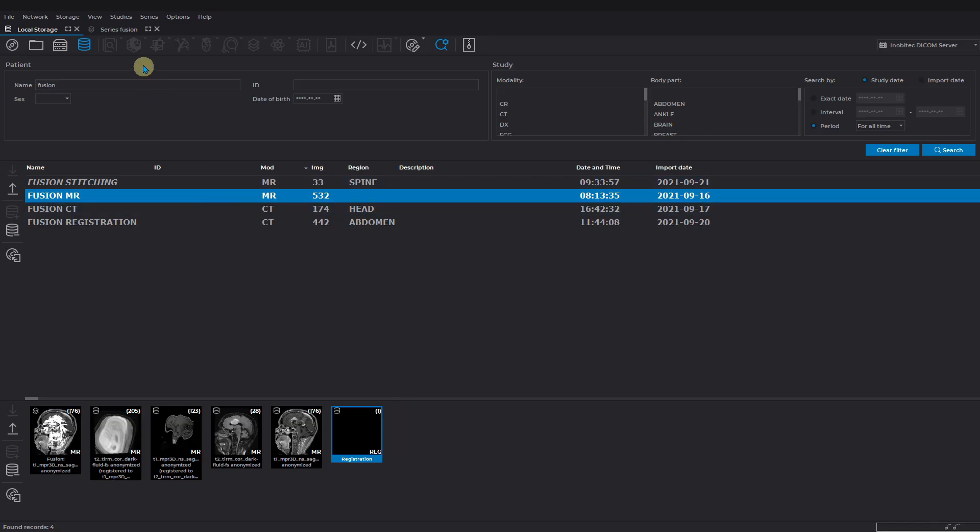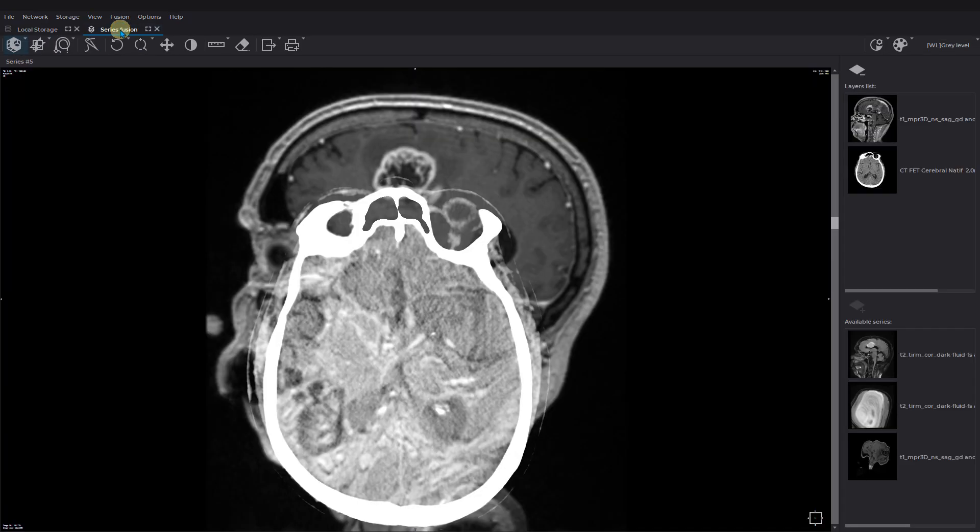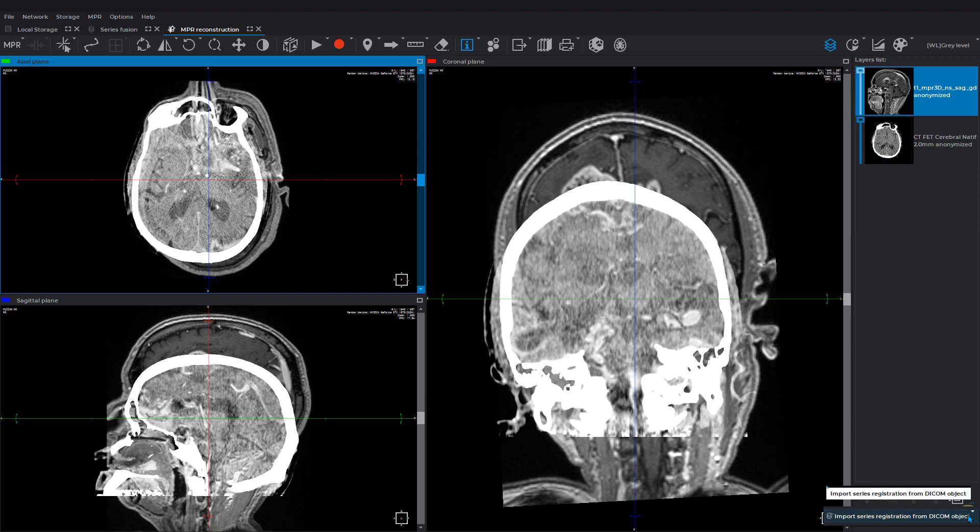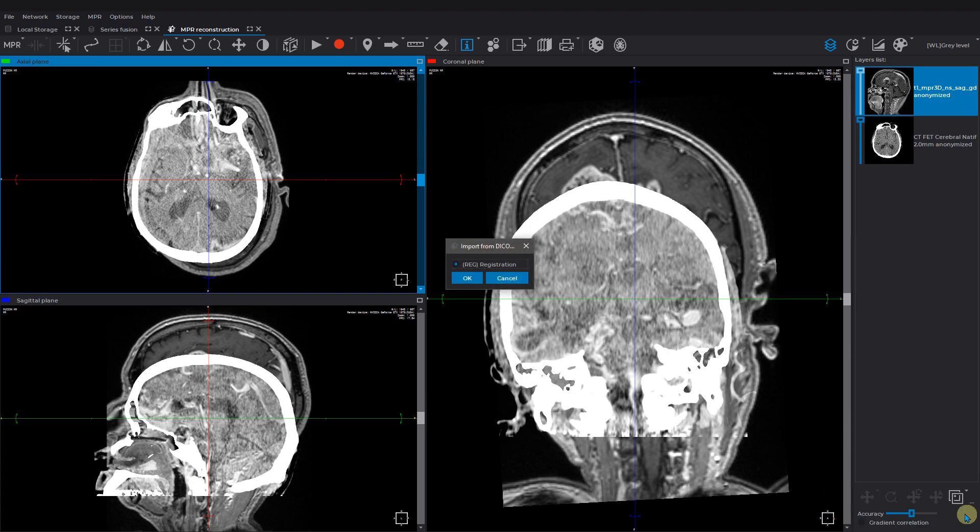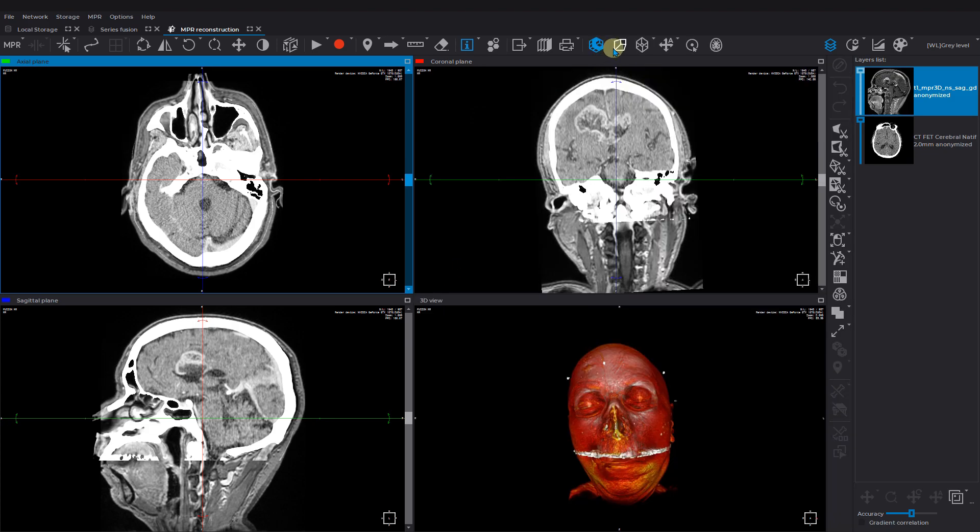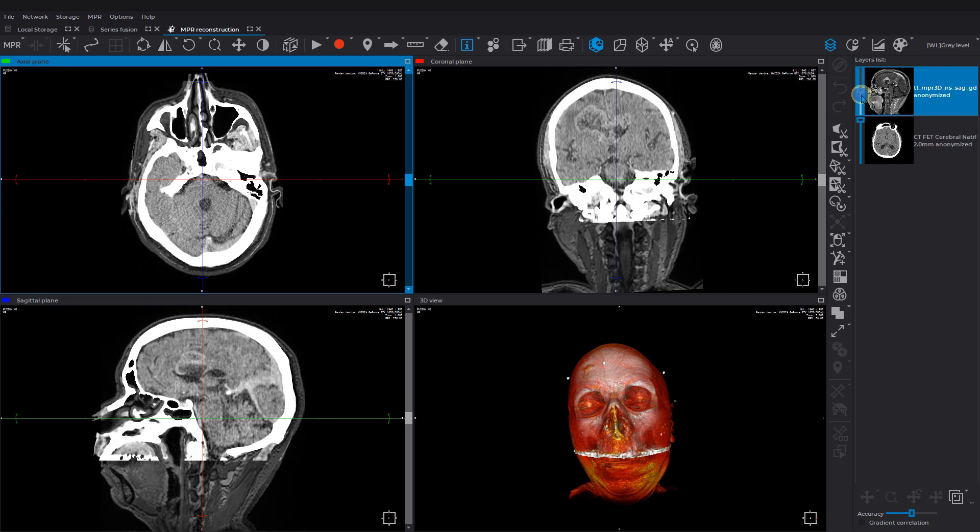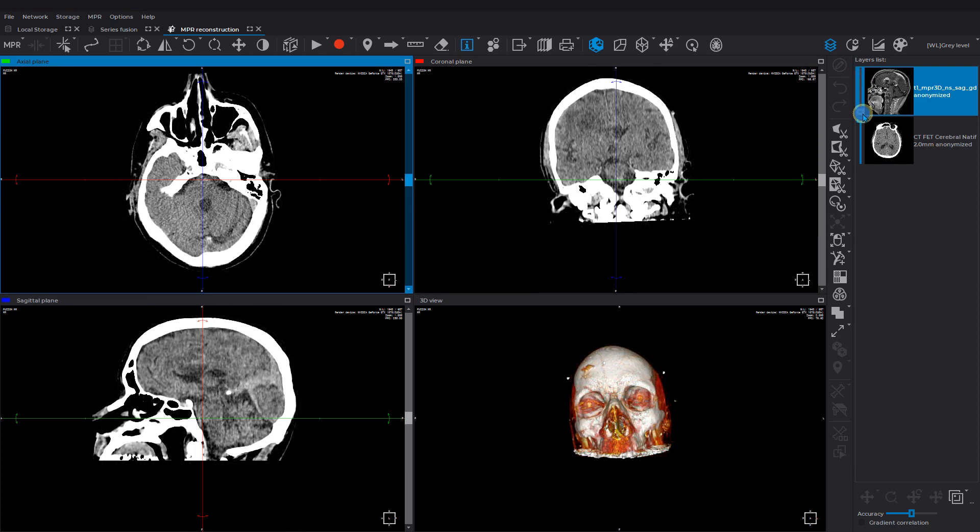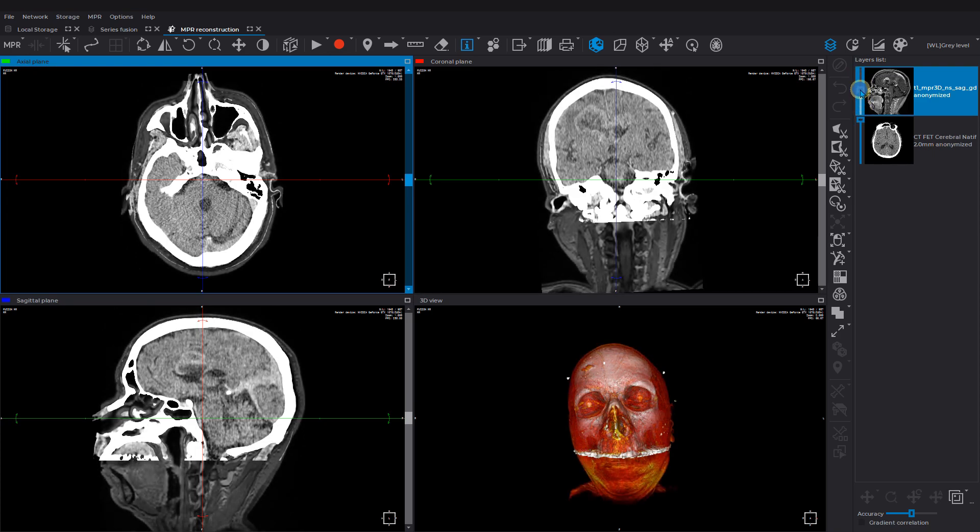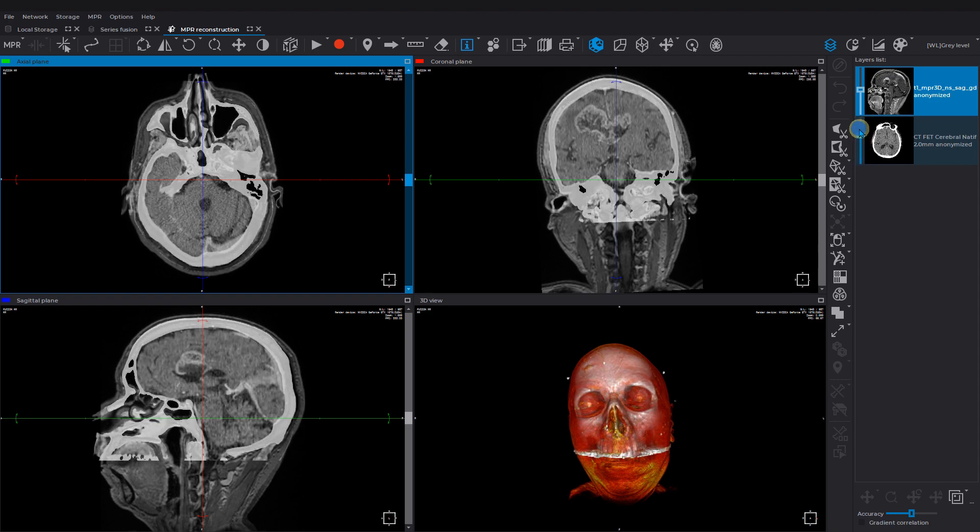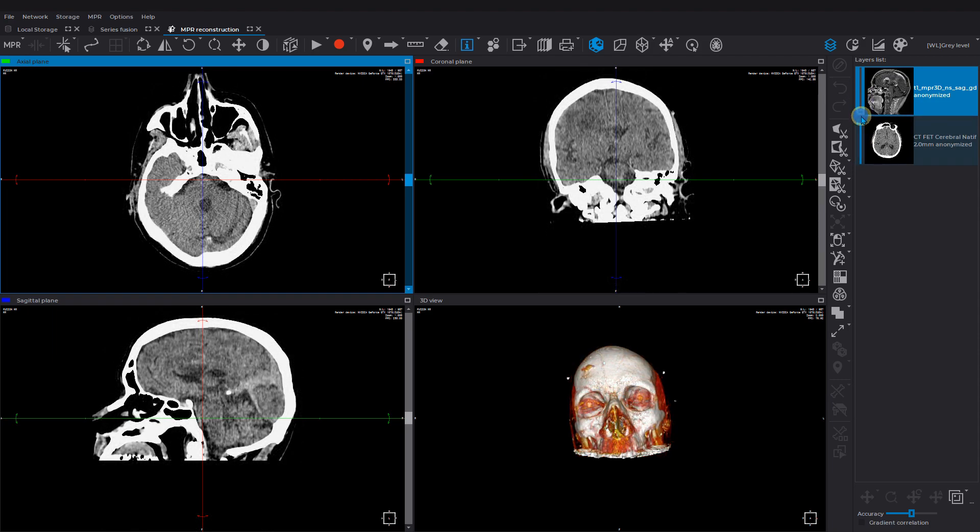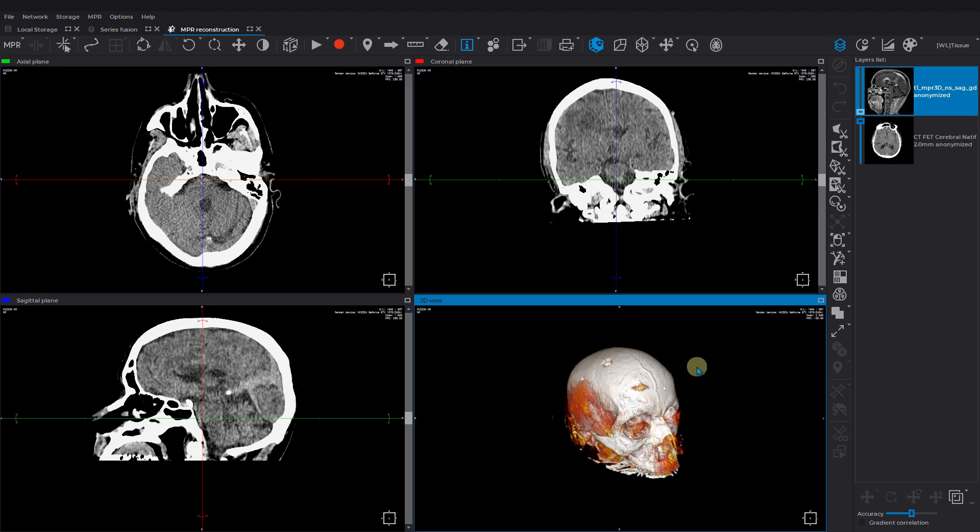Open the fused series on MPR mode to import the merge data. Activate the import tool and choose the respective series registration to import. The series is now registered. Now let's open the registered series on 3D view mode. The layers transparency is adjusted with the sliders on the left side of the layers thumbnails. The results you can trace on the MPR planes as well as on the 3D window.